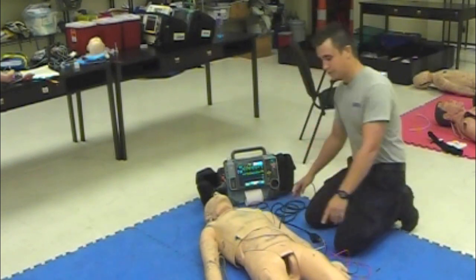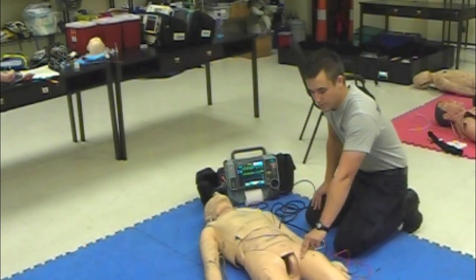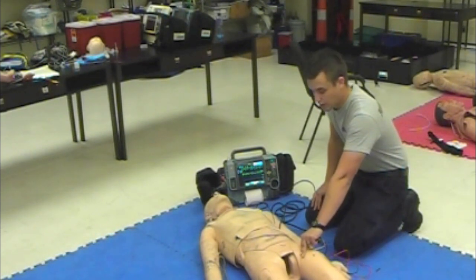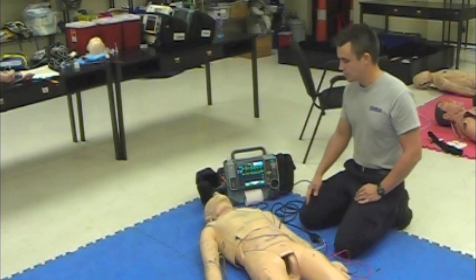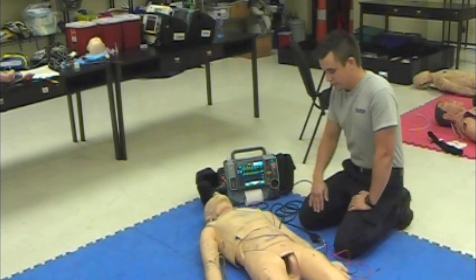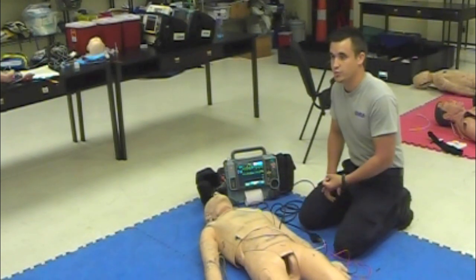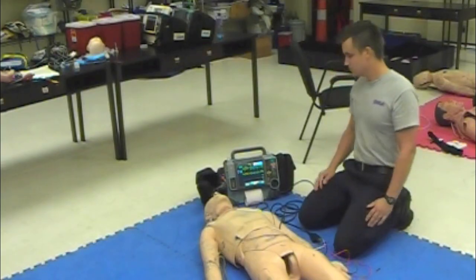And once I have electrical capture, I'm going to check for femoral and get a mechanical capture. Okay. Do I have that? You have a femoral pulse. Okay. So I'm going to reassess my vitals, and as he's ventilating, I'm going to get another blood pressure. 110/70. Okay. If his blood pressure does tend to fall back down into the critical level, I could consider dopamine or epi drips. Okay. All right. That's it. Thank you.